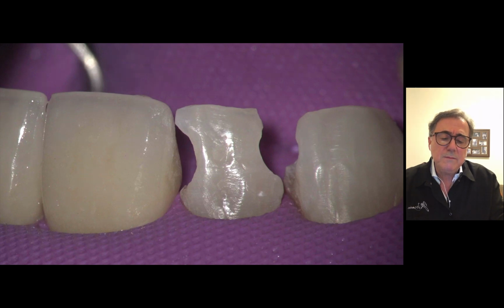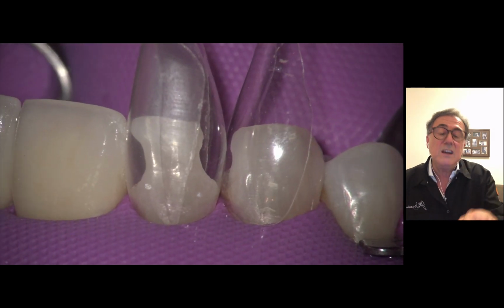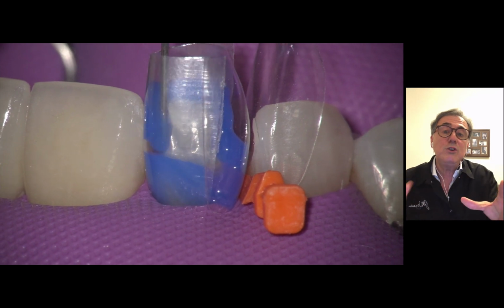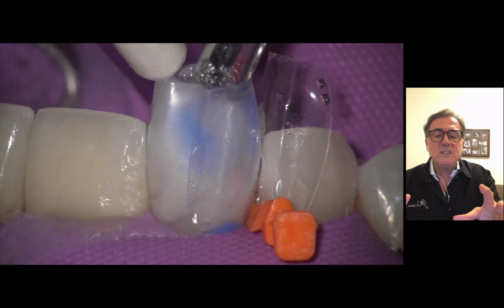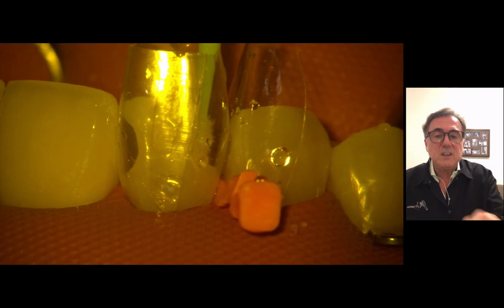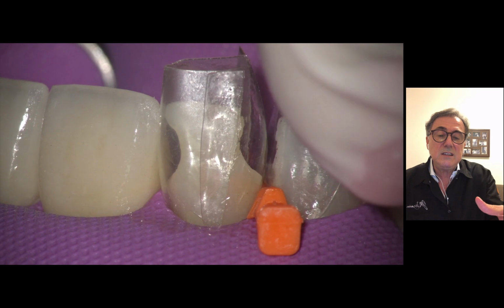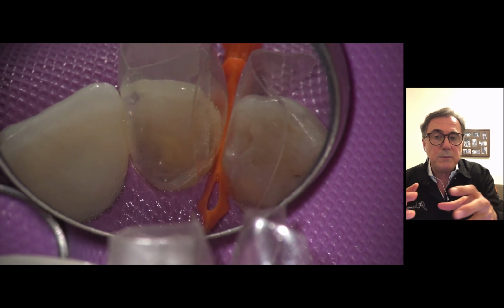So just to make sure, this is a case that we have. It's a very easy case, but we have a class 3 and some class 4. These are different matrices. Those are not the BTs. Those are the anterior Bioclear matrices. But the principle is the same. Just to show you once again how to do the injection molding. So you etch, you rinse, you place your adhesive. In this case, as we have a lot of dentin, we cure the adhesive and then make sure that the matrices are in the correct place.